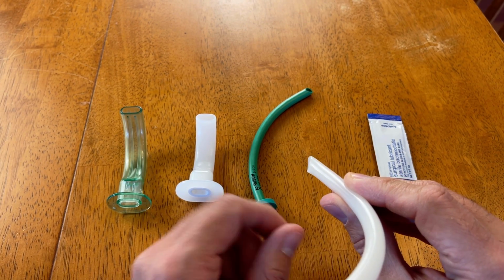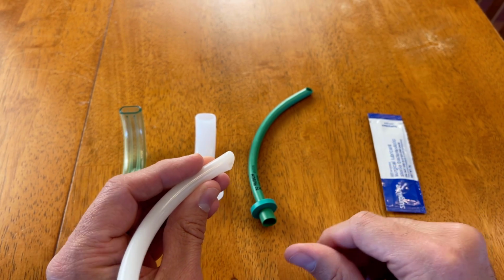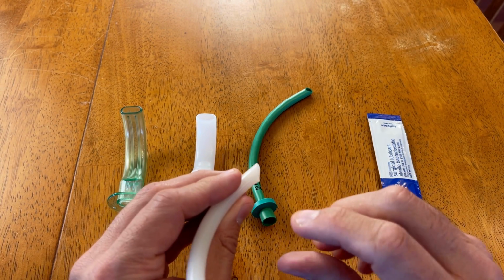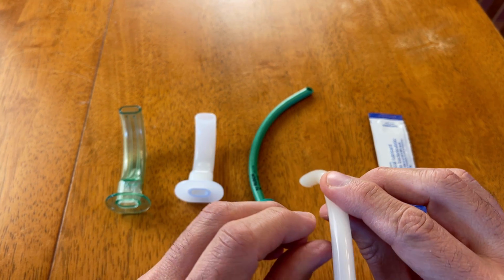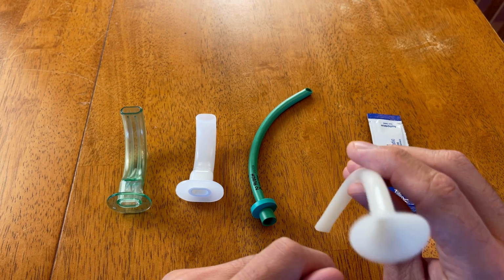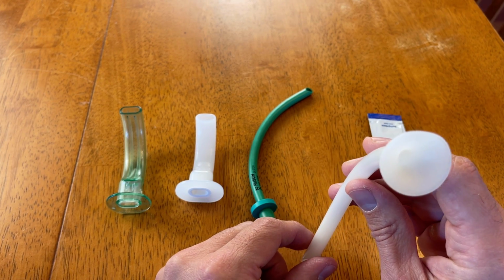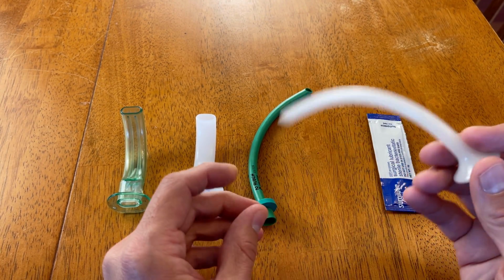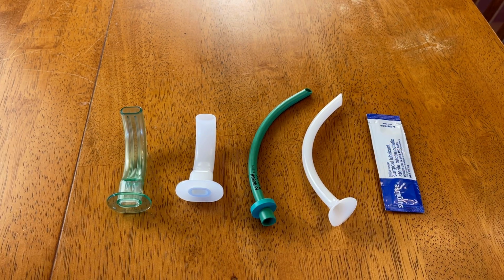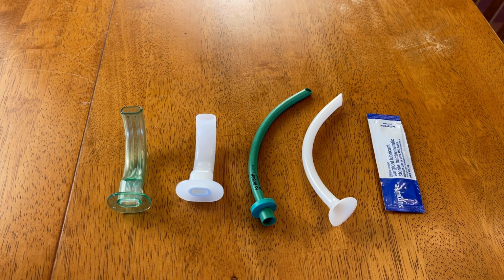Now, depending on what side it is, you may have to rotate this around to facilitate its passage. And you're just going to use gentle pressure, and if there's any resistance, you want to stop. But just use gentle pressure, and it should slide in quite easily. And then you just want to monitor your patient after you've placed it for their tolerance and airway patency. Like I said, make sure it doesn't become an obstruction in and of itself. So that's just a quick overview of the NPA.